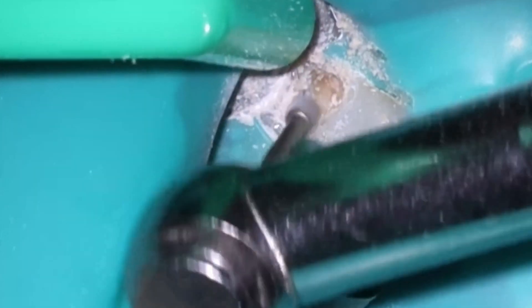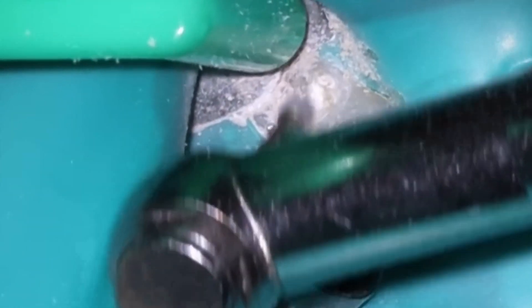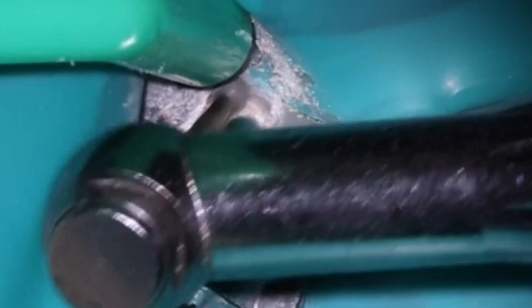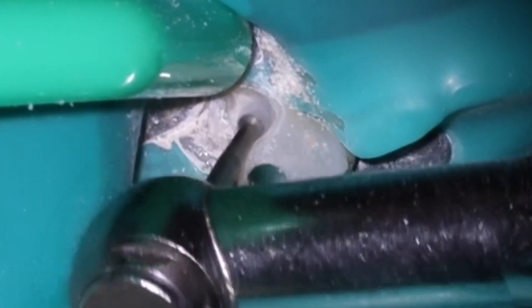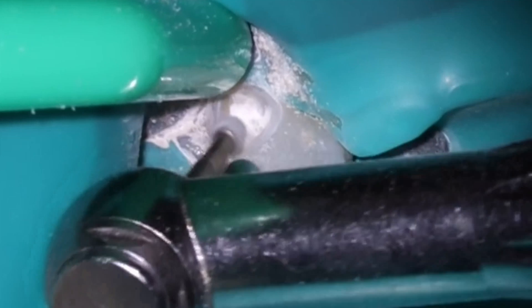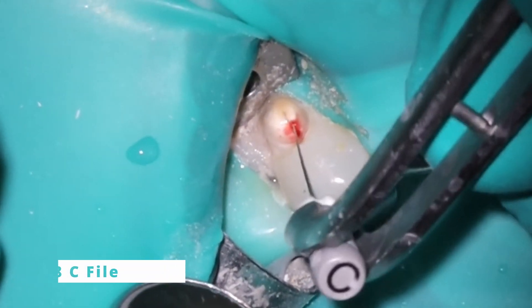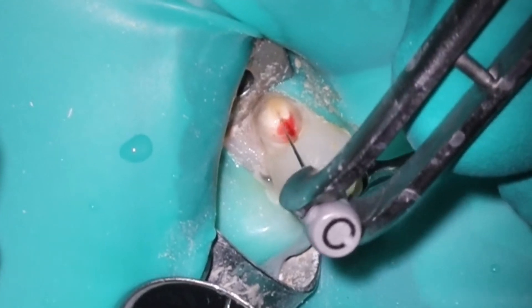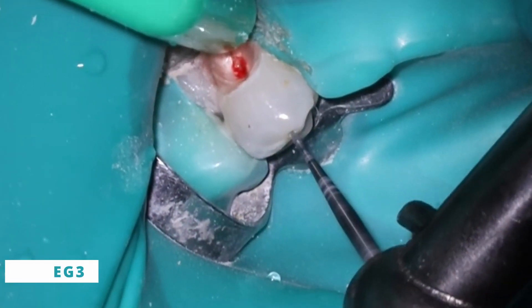When dealing with Class 5s, you do need to have the rubber dam down a little bit lower — I'm on the gingiva here just slightly. They do make rubber dams that work for sub-gingival, but in general this one was a little bit farther and I don't think the ones with teeth that dropped down a little would work very well. I always try to do the entire root canal from the buccal if possible, but if I can't get my 8C in, I need to go for a little more straight line access, so I'm going to use the EG3 to drop down.